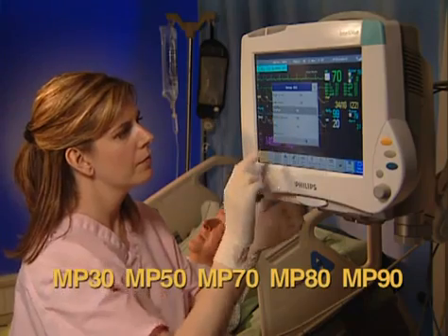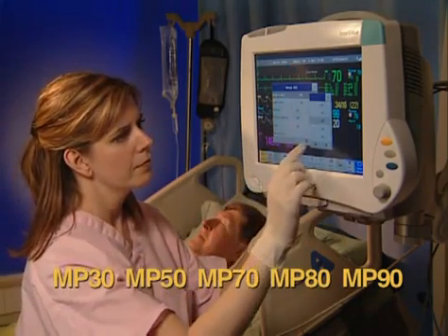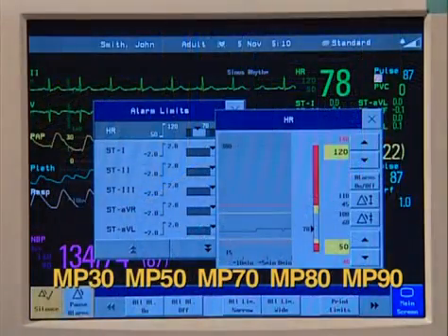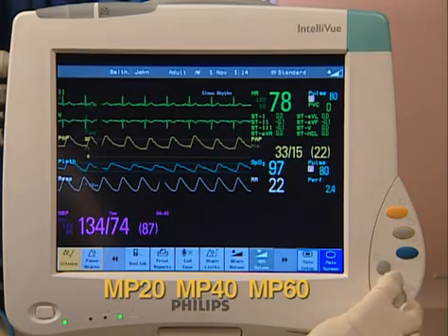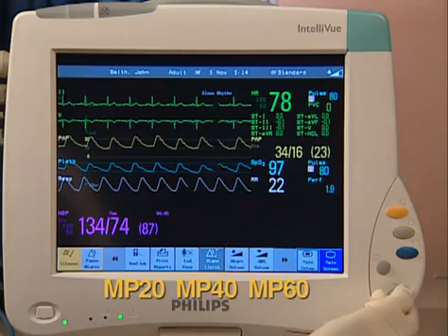The MP30, MP50, MP70, MP80 and MP90 use a touchscreen interface for navigation. The MP20, MP40 and MP60 offer the navigation point or speedpoint as primary input devices.